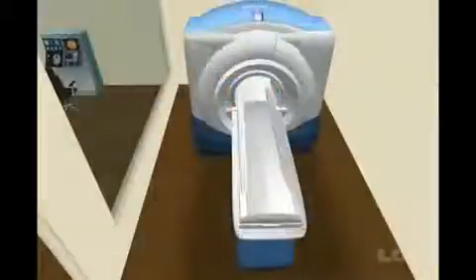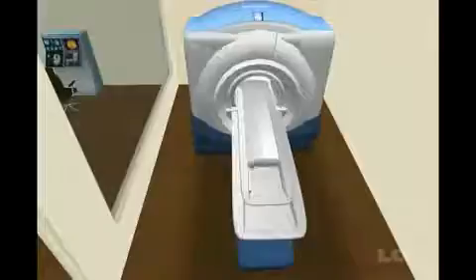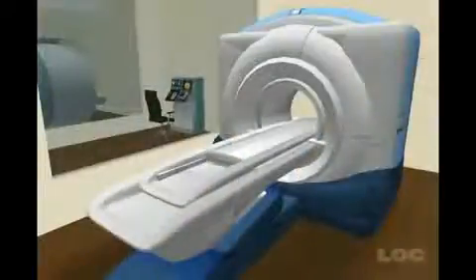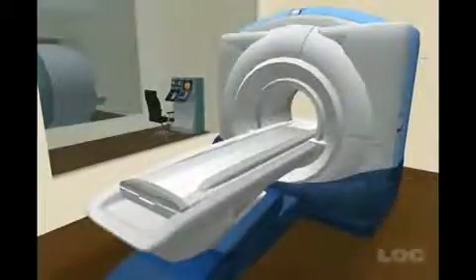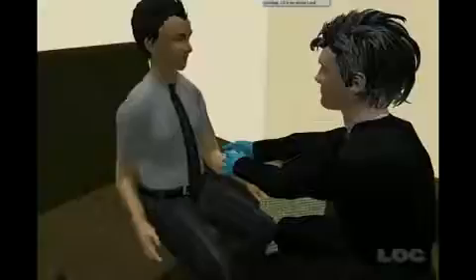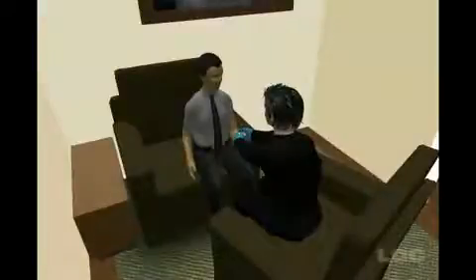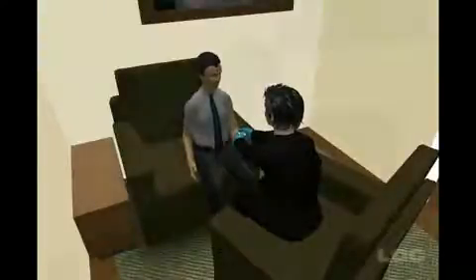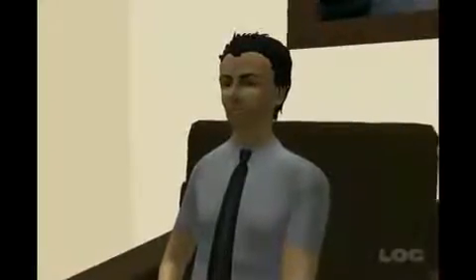The PET scanner also consists of a moving couch that slowly moves a person through a short tunnel. This is a bit narrower than a CT scan, but much wider than an MRI scan, and most people don't find that it causes claustrophobia. About an hour before the scan starts, a small needle is inserted into your arm for the injection of the radioactive substance. The time is necessary for the radioactive substance to be taken up by the tissues.